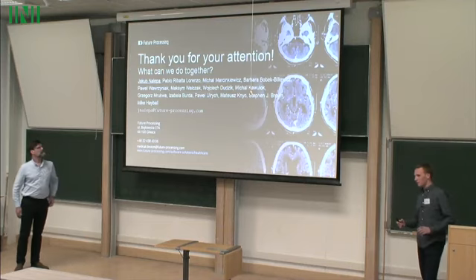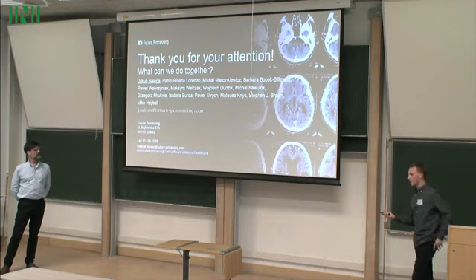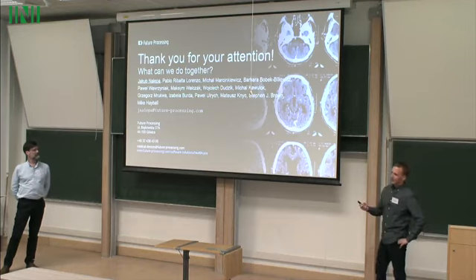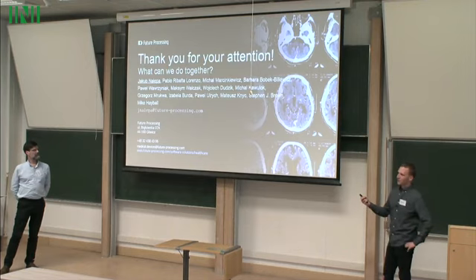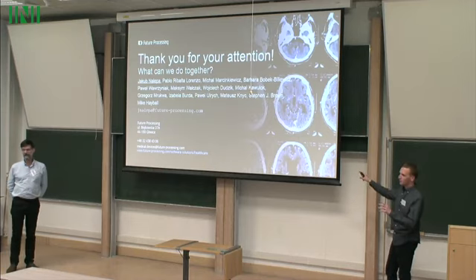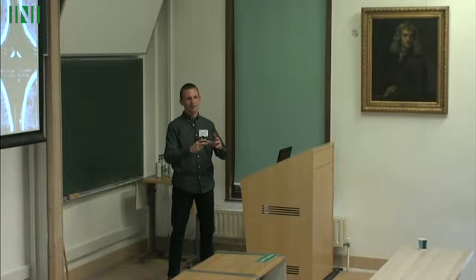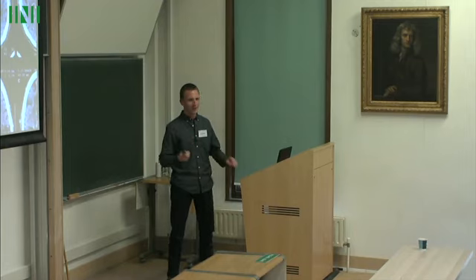So that would be the first step of the processing pipeline, to see whether the data fits our assumptions and whether the data is correct, although it might be correct in a different way. You may have a different scanner which produces different data which is still correct, but it's not correct in terms of our software. So we need to make sure that we only analyze that bit of information that we can analyze.